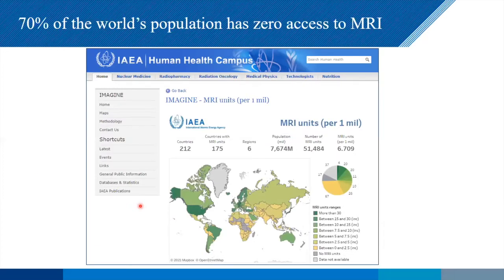And of course, that also got us thinking about accessible MRI, right? It's nice to have a 7T, it's nice to have 1.5T, but if we actually look at the role of MRI in healthcare worldwide, we can see this in terms of vaccine rollout now. 70% of the world, this is irrelevant. They don't have the resources for any kind of MRI. And the question is whether these kind of low field systems could potentially start to help in this problem.